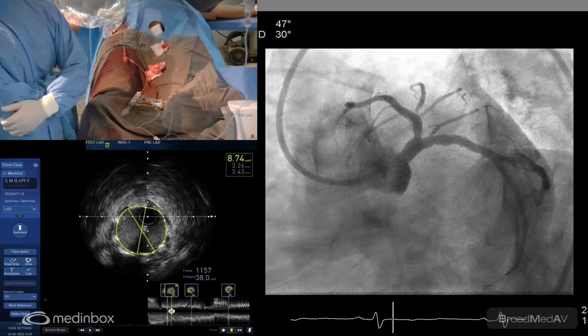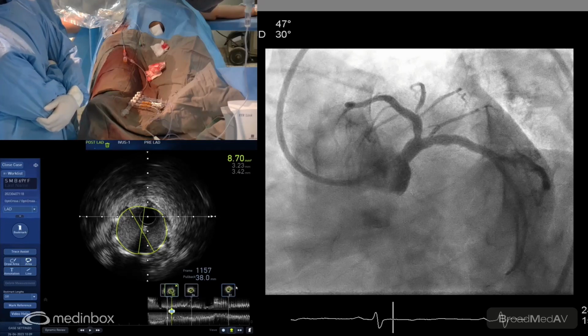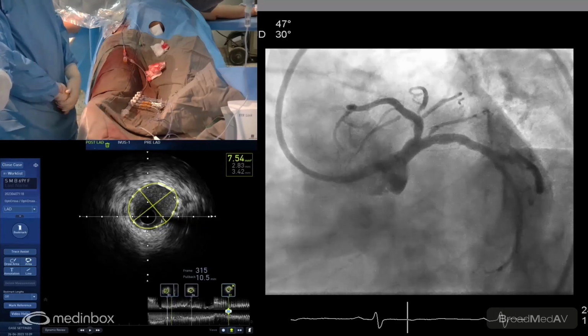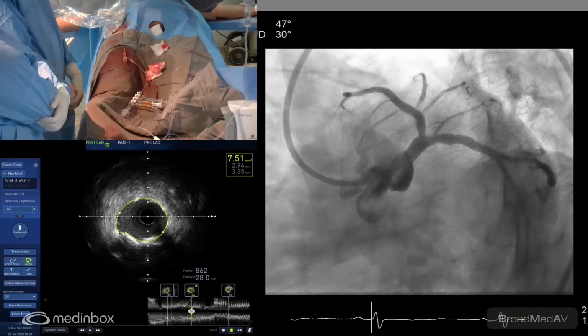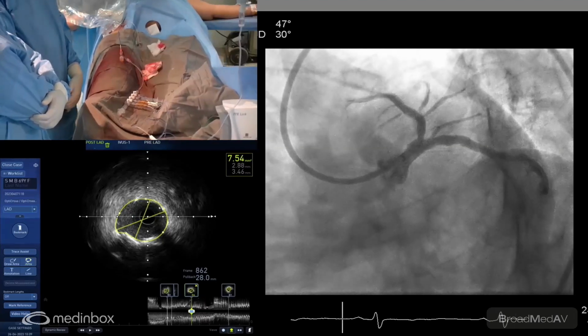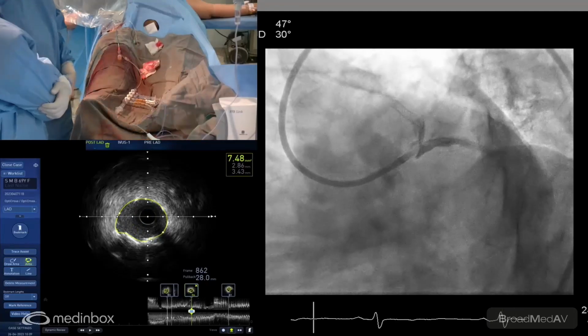And Ashish, are you okay with the whole thing? Yes, sir. So the stent expansion is good. Diagonal is flowing. There's not much of CAC changes. No, patient is not having any discomfort. So I think we are good to go. So thank you very much for the first case, and we'll quickly go on to the other lab for showing you the second case.